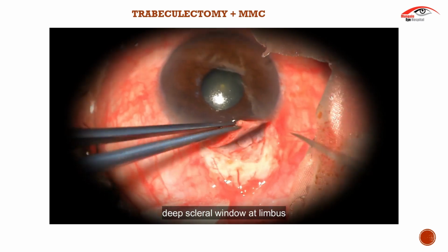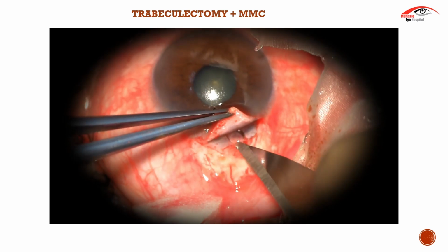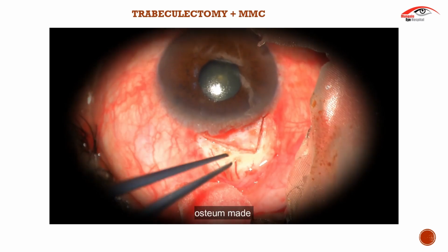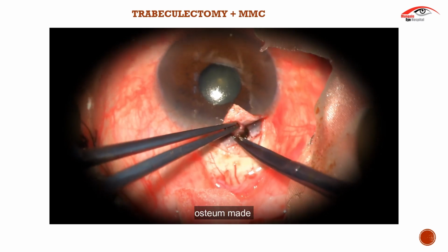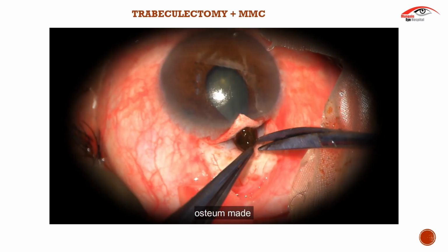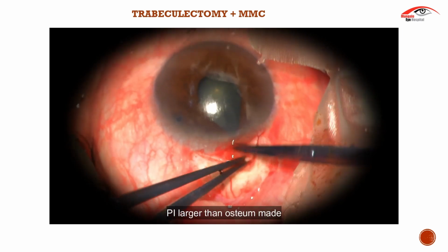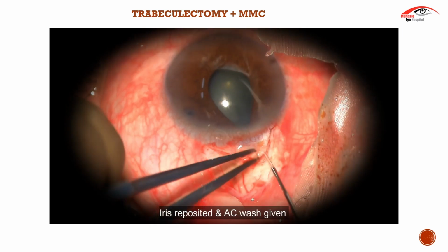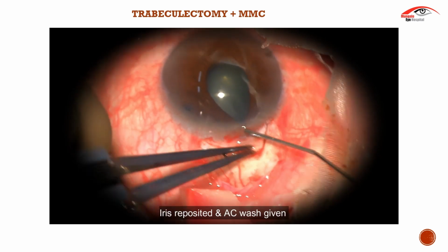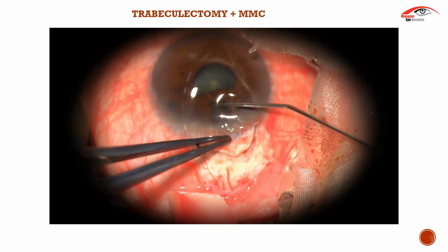After creating a deep scleral window, an ostium is made. A peripheral iridectomy larger than the size of the ostium is created. The iris is reposed back and the anterior chamber is formed with balanced salt solution.